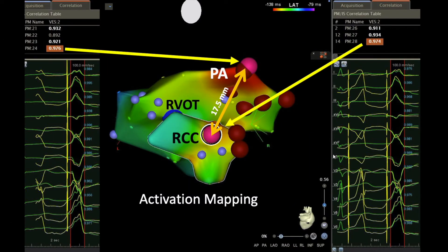At the beginning of the procedure, we started mapping the RVOT without mapping the pulmonary artery. The earliest point was around minus 20 milliseconds and the pacemap was just 94 or 95 percent, and the ablation was without effect and unsuccessful. Therefore, we started mapping the right coronary cusp. In the right coronary cusp, we had an activation around minus 30 milliseconds and a perfect pacemap with a PASO score of 97.4 percent.